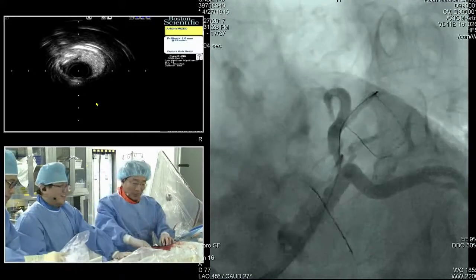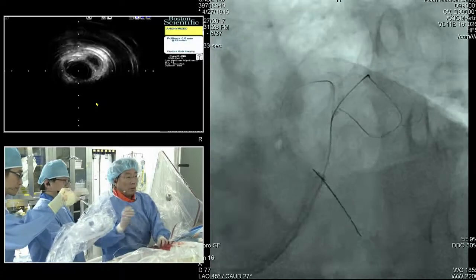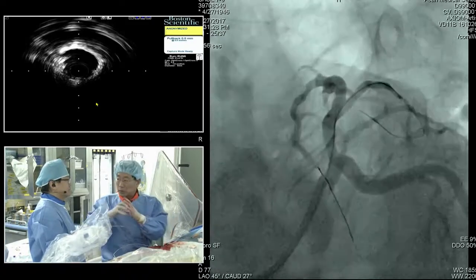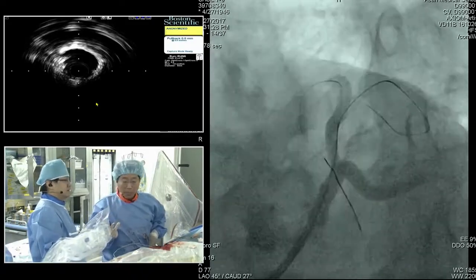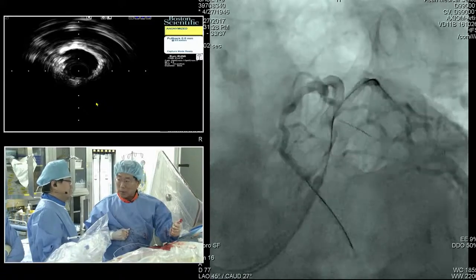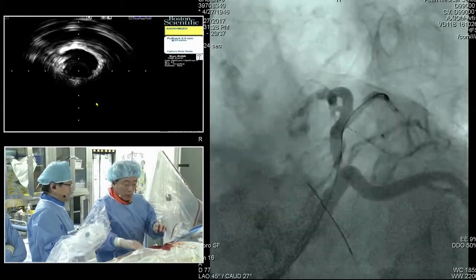However, when you use two stents, in almost all cases, with high pressure, the effective stent area compared to the balloon diameters, that's the clinical outcome. Exactly no difference between the single stent, provisional T stent, and two stent technique. We have lots of data.